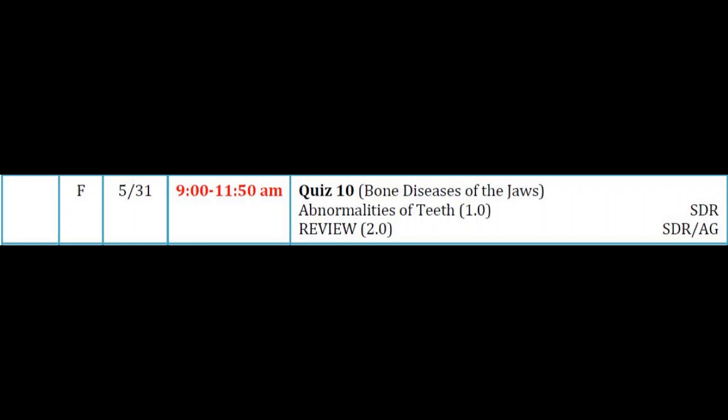And you'll notice also what is different about these teeth radiographically, besides the narrow short roots and the bell-shaped crowns. No pulp chambers. No pulp chambers. So that's very, very characteristic of dentinogenesis imperfecta for type 1 and type 2.